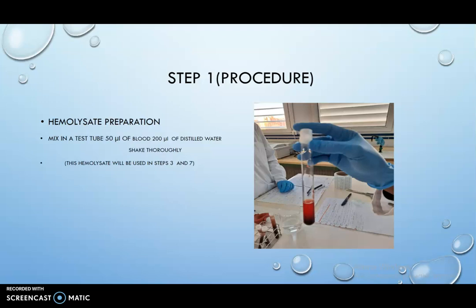Step 1: Hemolysate preparation. Mix in a test tube 50 microliters of blood and 200 microliters of distilled water, and shake thoroughly. This hemolysate will be used in steps 3 and 7.